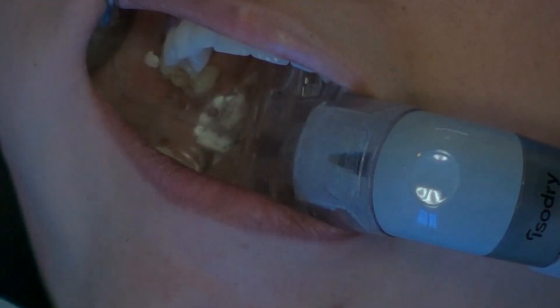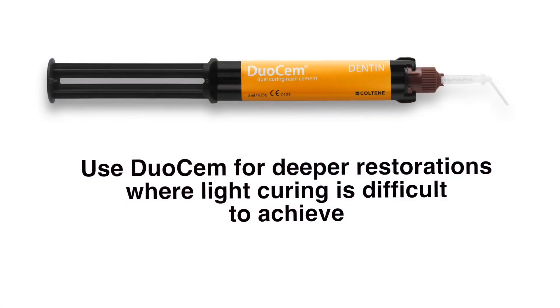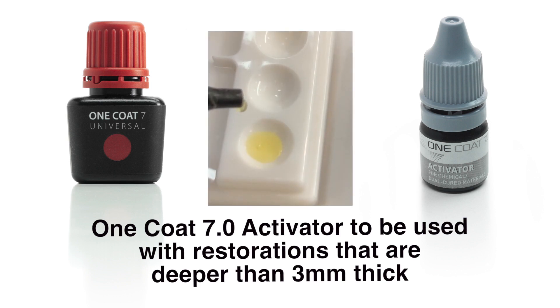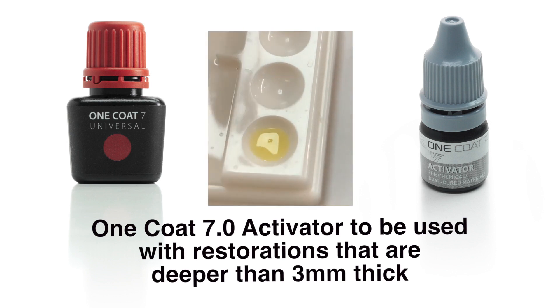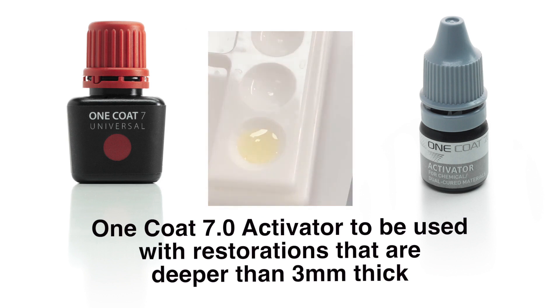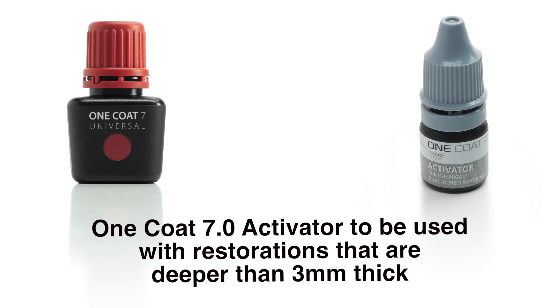Depending on the thickness of the restoration, use a cement such as Duo-Cem to lute the restoration to the tooth if the thickness of the restoration or the depth of cure is deeper than the operator feels comfortable curing with light activation only. Apply one coat seven universal to a dispensing well and add one drop of the one coat seven activator. If the thickness of the restoration is less than three millimeters thick, you may skip the addition of the activator.